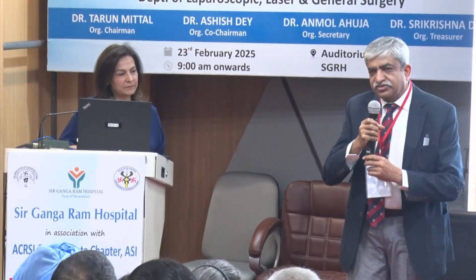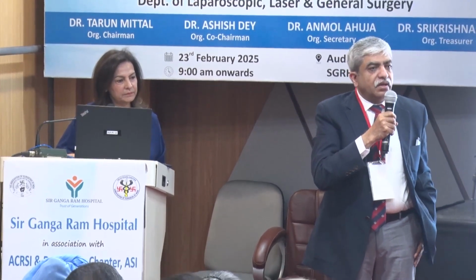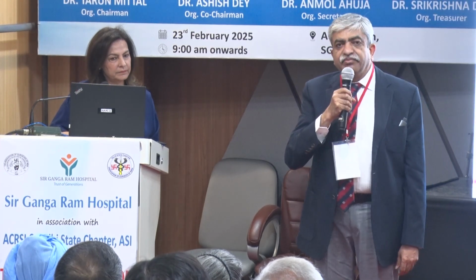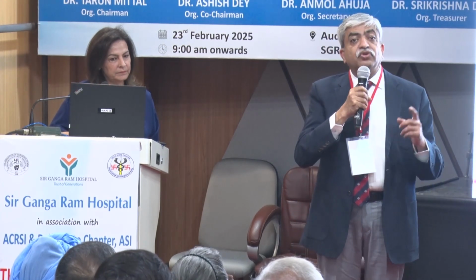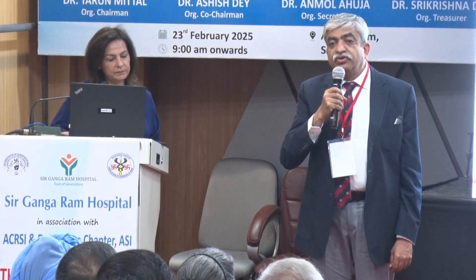No, probably not. The guidelines published by the American Society are that if the external opening is 2 centimeters away from the anal verge, if you have a posterior horseshoe-shaped fistula, if you have a recurrent fistula, if you have a complex fistula on examination, that means associated abscesses, a supralevator abscess suspected, or you have fibrosis in the anal canal because of previous surgery, these are the patients in whom you will probably get the maximum yield from MRI.